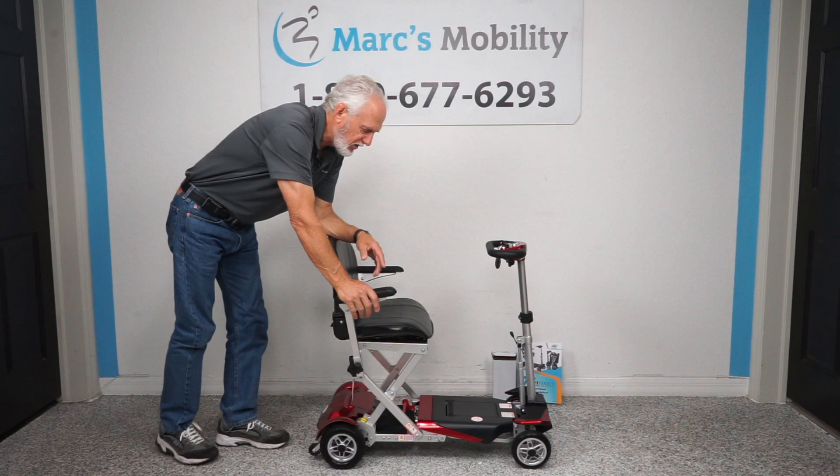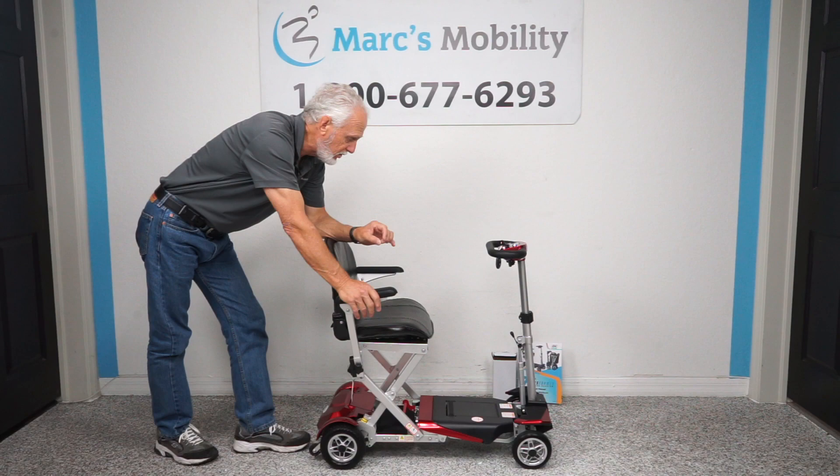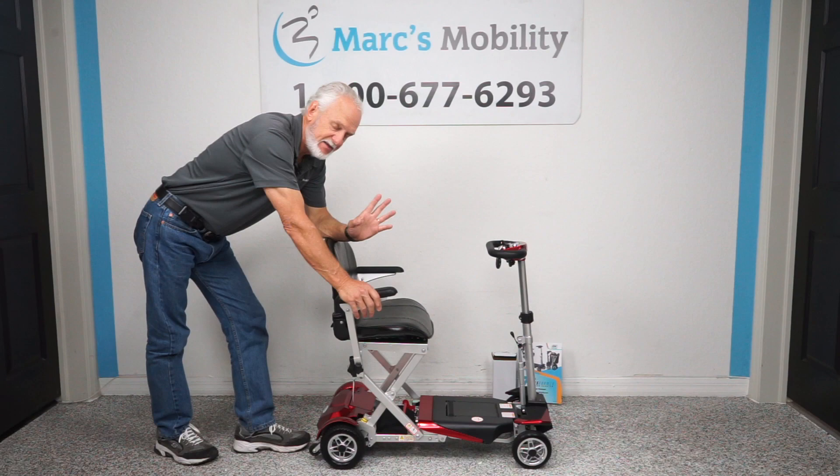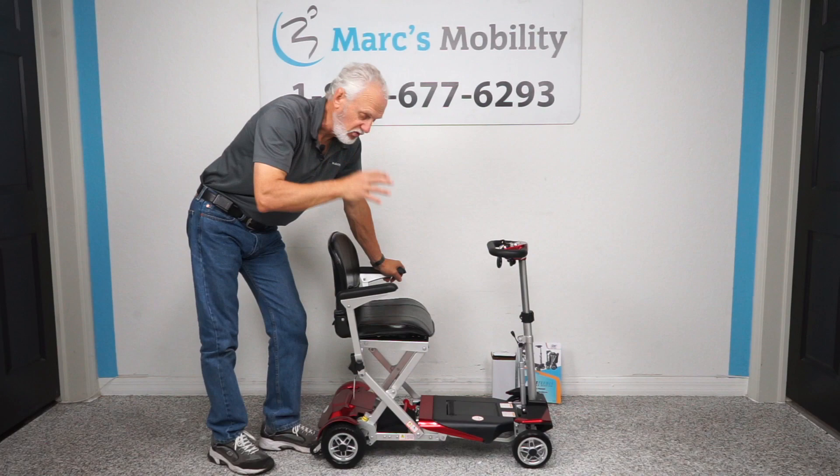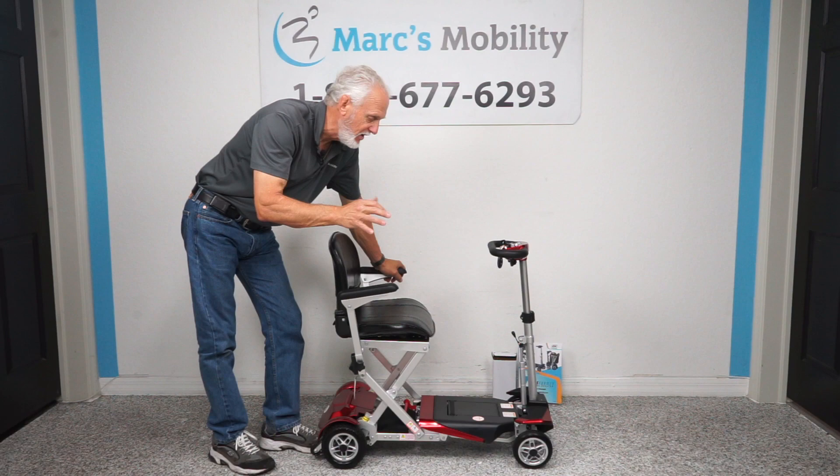The scooter comes in four different colors: red, blue, yellow, and black. The scooter has a travel distance on one battery charge — it's a lithium battery — of up to 13 and a half miles. That all depends on the weight of the user; if you're in the grass or going fast, you may not get 13 and a half, but the manual says up to 13 and a half miles on a battery charge.